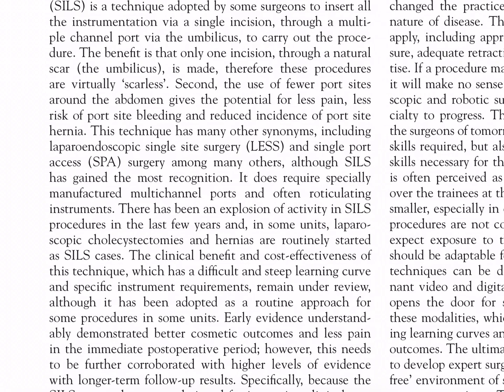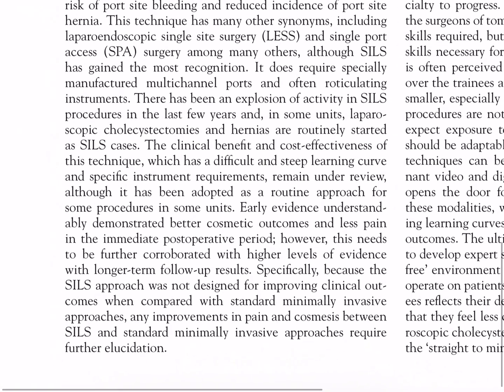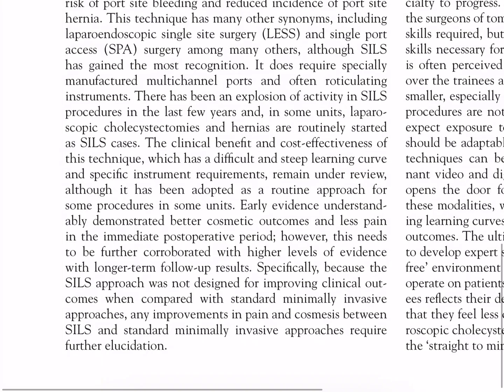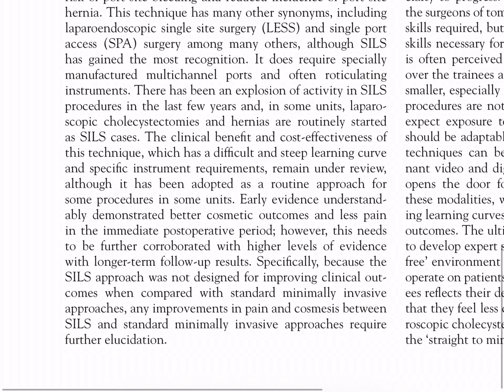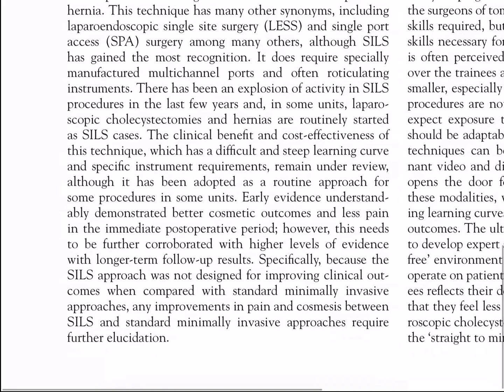There has been an explosion of activity in SILS procedures in the last few years, and in some units, laparoscopic cholecystectomies and hernias are routinely started as SILS cases. The clinical benefit and cost effectiveness of this technique, which has a difficult and steep learning curve and specific instrument requirements, remain under review.